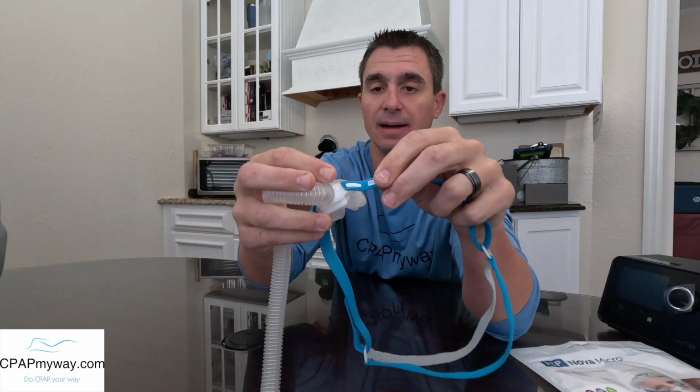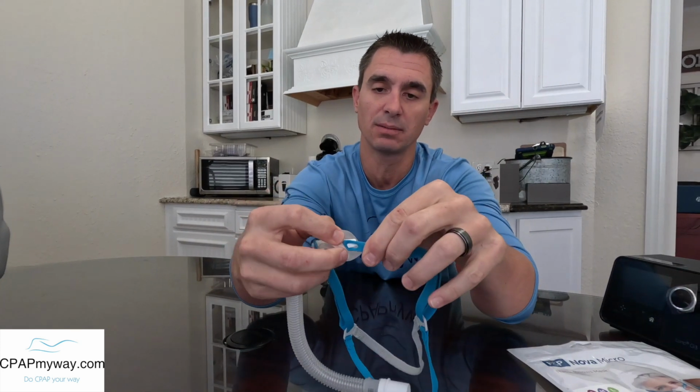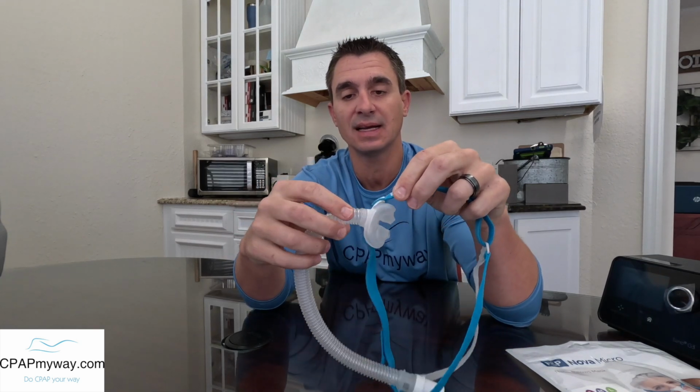So hopefully you can see that. Because of the way you're doing that, I think eventually you're going to wear that out. Because of the way the headgear fits, it'll always pull tight, but I think eventually you're probably going to wear that hole out a little bit, and you're going to have to replace the headgear. So I would recommend when it's maintenance time to just leave the headgear and the frame attached and do your maintenance with it all attached.